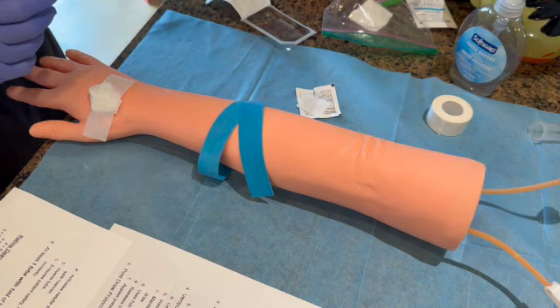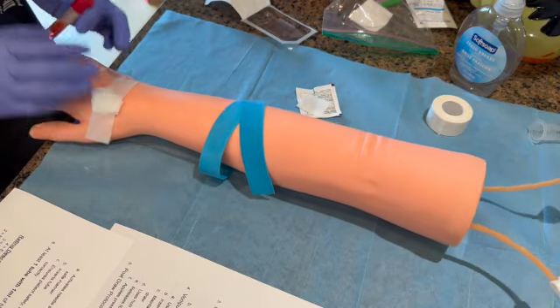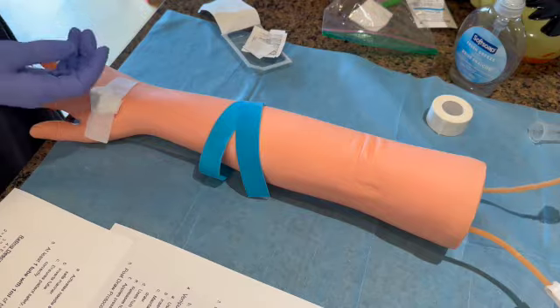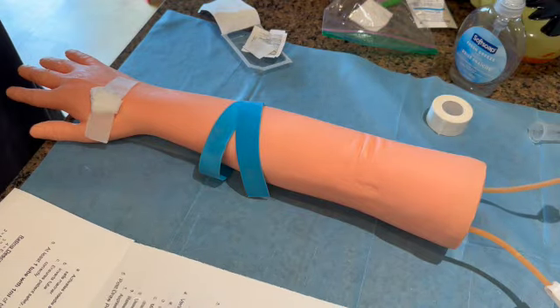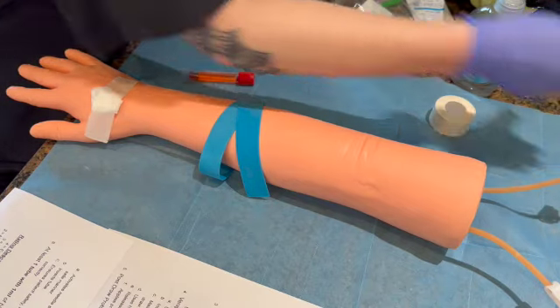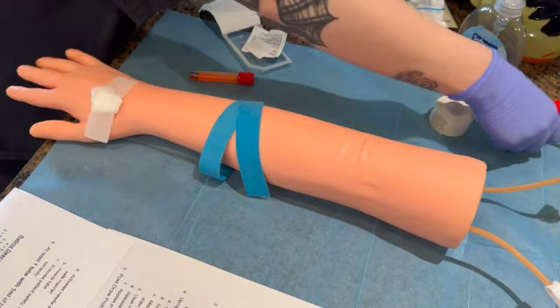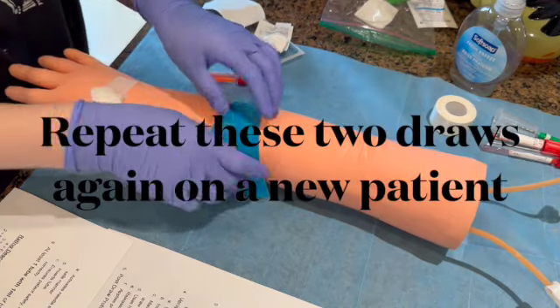We are inverting our tubes. We're ensuring that the patient is safe, they're not bleeding anymore, and we're disposing of all materials accordingly, and this is going to the lab. So at this too, we've met the requirement of at least 1 tube with 1 milliliter of blood obtained, whereas with our straight needle venipuncture, we are making sure that we have at least 2 tubes with 1 milliliter of blood obtained.